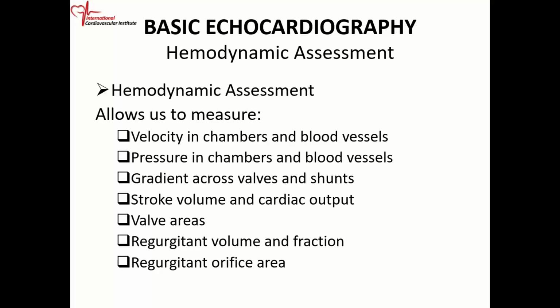We can also use hemodynamic data to look at shunts, atrial septal defect, ventricular septal defect, and we can characterize the magnitude of the shunt as well. Stroke volume, if you remember, is the volume of blood that's pumped from the ventricle per beat. So we can use hemodynamic principles to calculate stroke volume.